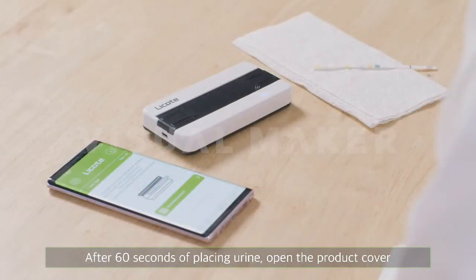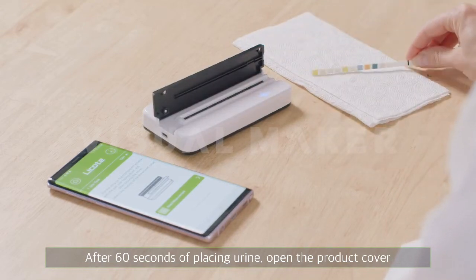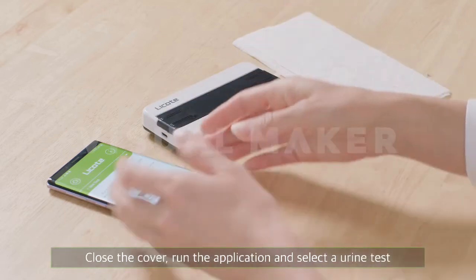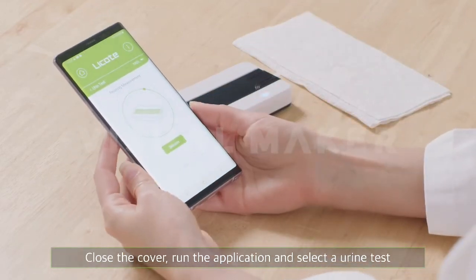After 60 seconds of placing urine, open the product cover and place the applied strip on the window. Close the cover, run the application, and select a urine test.